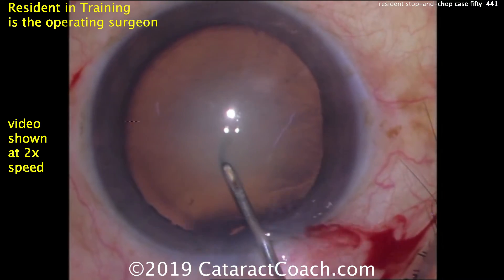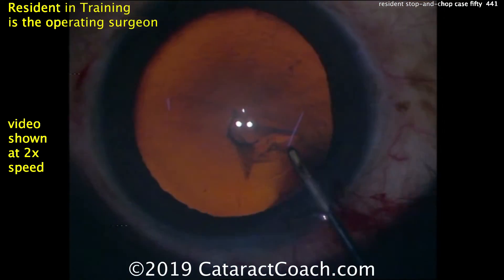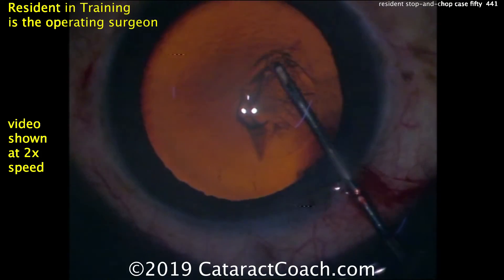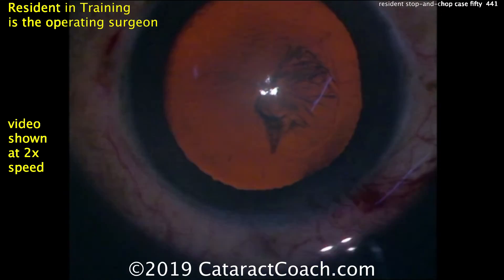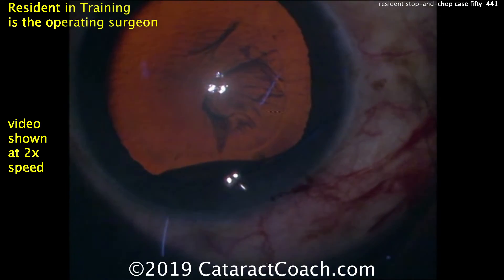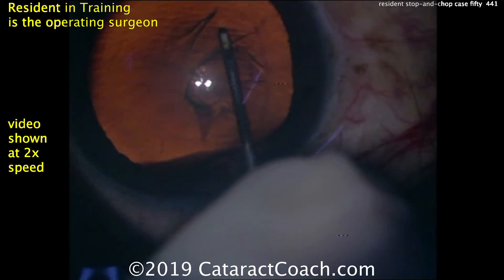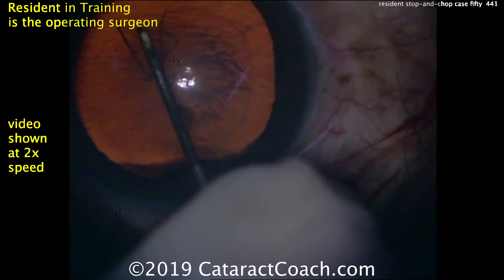Now it's time to make the capsulorhexis. You can see the lighting has been switched — the two strong dots on the cornea are the retro-illumination lights, the coaxial lights, and the smaller tiny dot is the other light that gives illumination off to the side. To enhance the red reflex, the stereo coaxial one is very bright and the paraxial one is not. More viscoelastic was added.